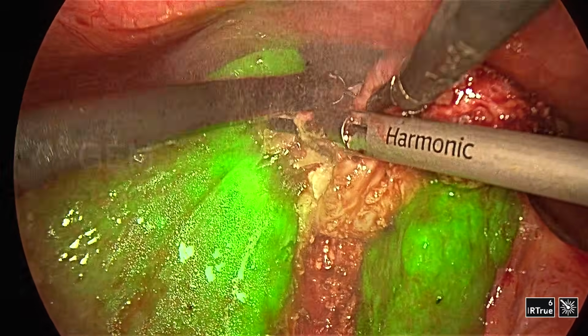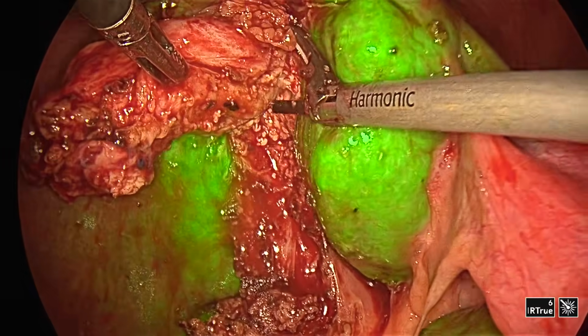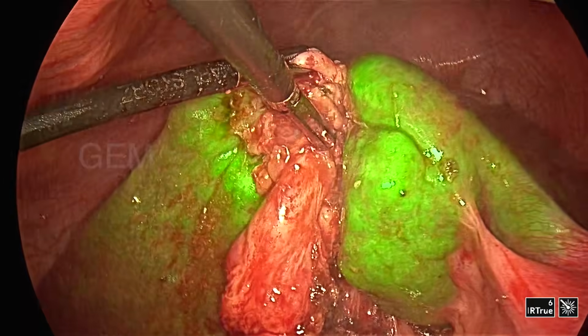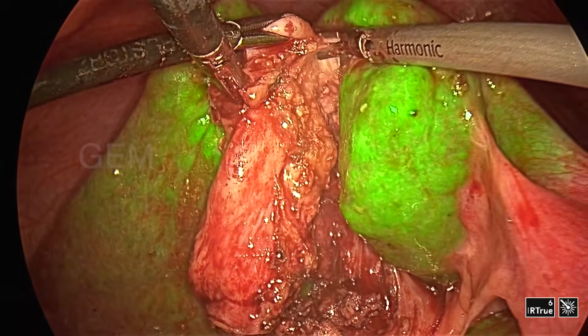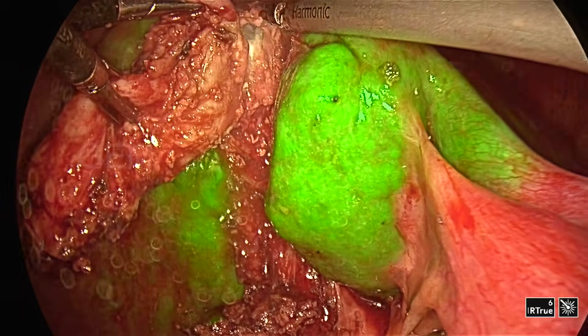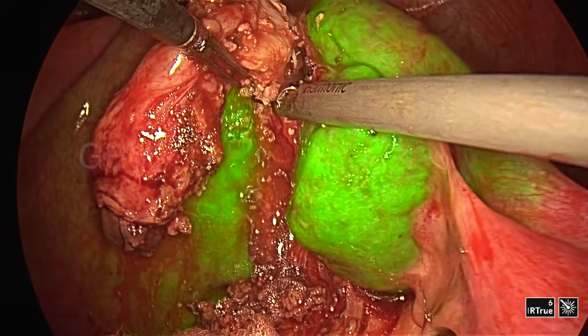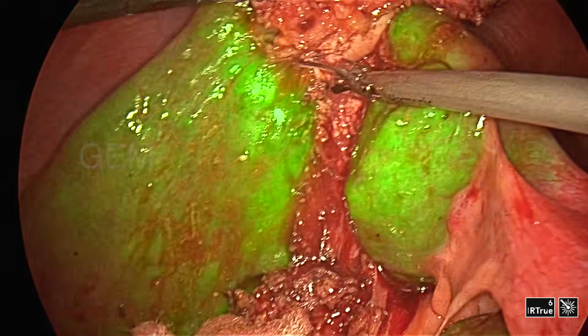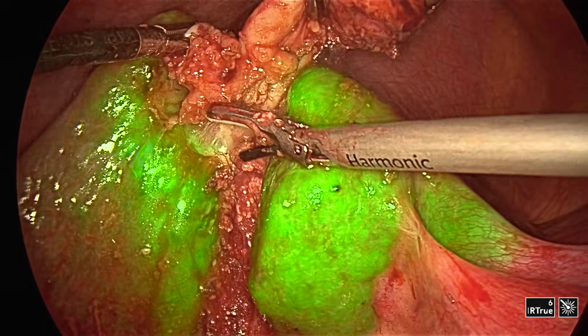And in some cases of adhesiolysis also I give it the previous day night. When you are doing adhesiolysis, I could see the bowel is green color, and then the adhesions will be pink color. So I could see the line of demarcation is very well seen. So that will be helpful for adhesiolysis. So always for gallbladder, give this ICG 1 day prior, the previous day night.